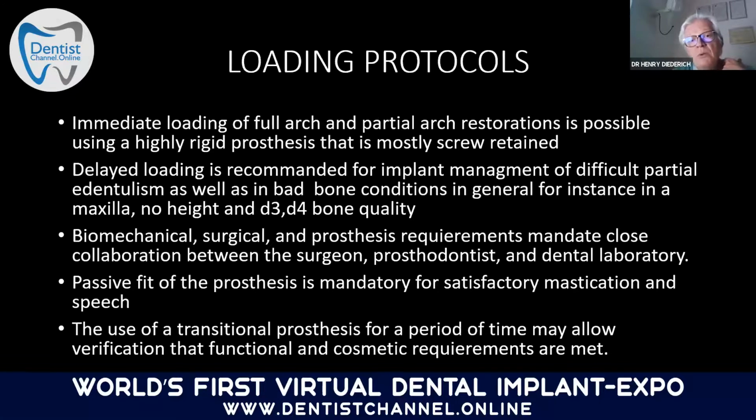So loading protocols: immediate loading of full arch and partial arch restorations is possible using highly rigid prosthesis and is mostly screw retained. Delayed loading is also recommended if the bone quality is not good. We need a passive fit of the prosthesis, which is mandatory for satisfactory mastication and speech, and the use of a transitional prosthesis for a period of time may allow verification that functional and cosmetic requirements are met.